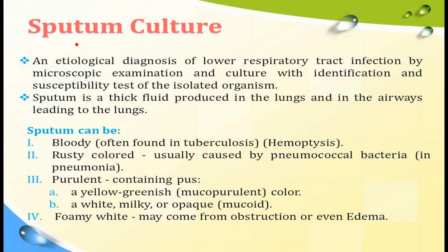Here, a brief overview of sputum culture is given. First point in sputum culture is an etiological diagnosis of lower respiratory tract infections by microscopic examination and culture with identification and susceptibility test of the isolated organism.